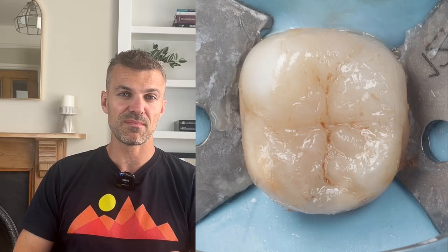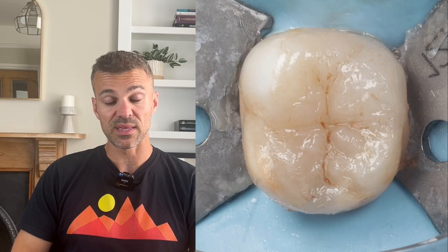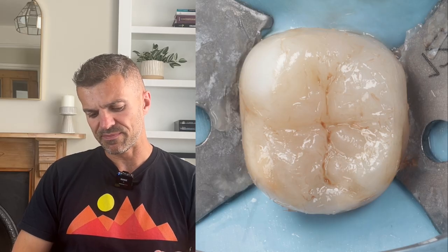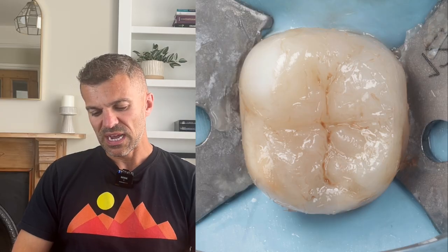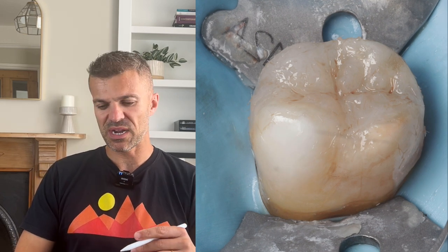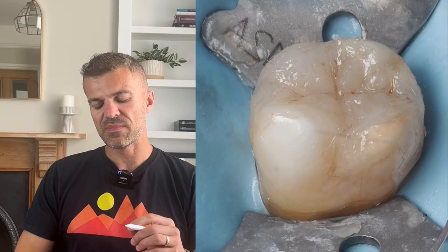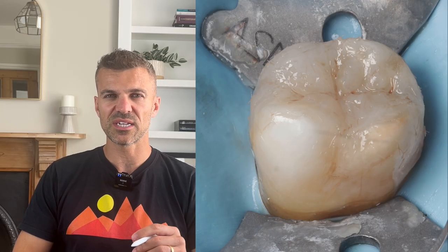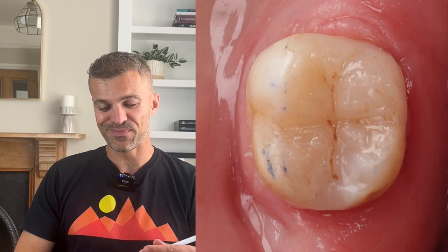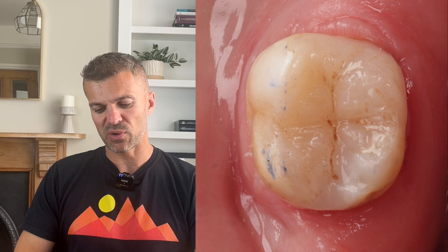Now it's just a case of following the cusp inclines. Hopefully the height of the cusp I've put in is going to match and copy what was already there. I can use composite to match the anatomy, copying where the embrasures and fissures are to guide some simple shaping, then adding a little bit of tint just to help it blend in. Looking at it from the side, we can appreciate that the heights are pretty much there or thereabouts. These will often take a little bit of adjustment in the mouth, but if we're making subtle changes to a cusp angle or cusp tip height rather than reshaping the entire occlusal surface, that's going to work out a lot better. Then it's cross your fingers, check the occlusion — got away with it on this one. I gave it a little bit of a polish and that was about it.